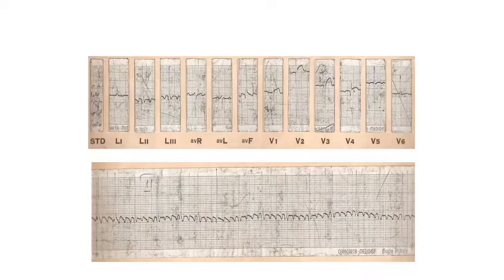Sir, we have to see 2, 3, aVF for flutter. Typical flutter, sir. Yes, it is typical flutter. Flutter waves are best seen in leads 2, 3, aVF. That is suggestive of a typical flutter.